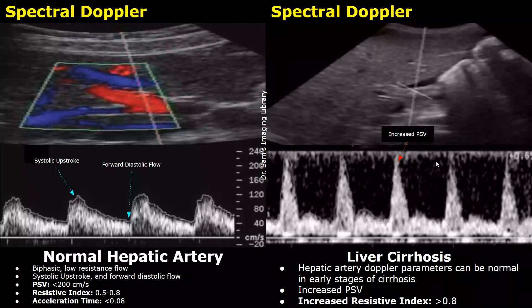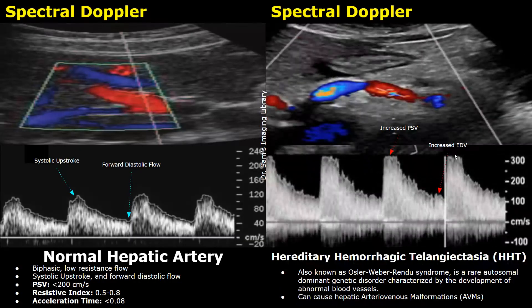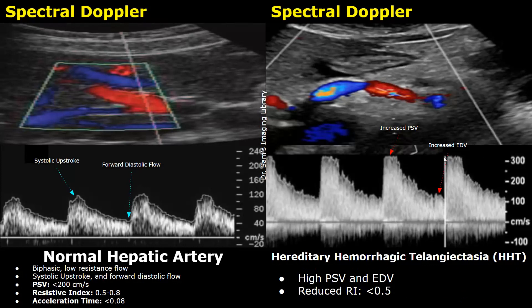The hepatic artery can also be evaluated in cases of cirrhosis, though portal vein evaluation is more significant and important. In early stages of liver cirrhosis, hepatic artery Doppler parameters can be normal, but in severe cases abnormalities may be present — the PSV and resistive index can be elevated. Hereditary hemorrhagic telangiectasia (HHT) is a rare autosomal dominant genetic disorder in which abnormal blood vessels develop. If the hepatic artery is affected, it may present as an arteriovenous malformation affecting the hepatic vasculature. In this case of HHT, we can see a very high PSV exceeding 300 cm per second, and the end-diastolic velocity is also very high — over 100 cm per second.